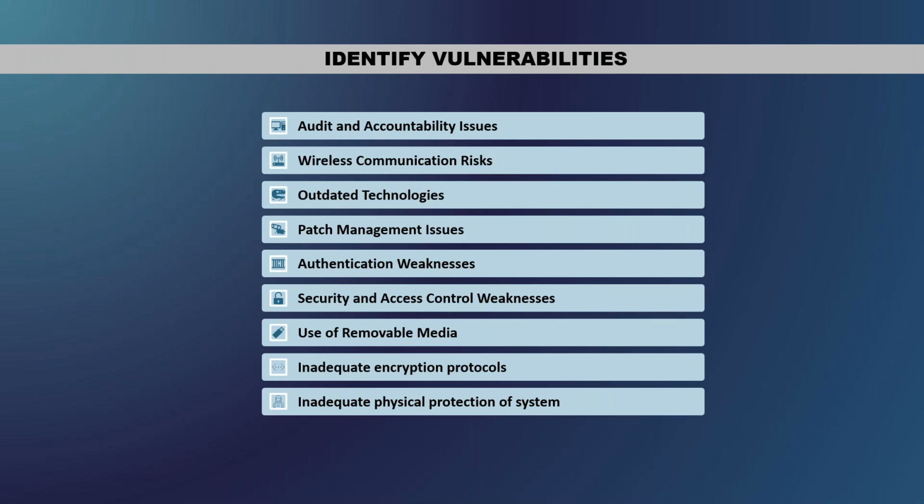So the lack of robust authentication and authorization procedures can also make medical devices vulnerable to unauthorized changes, as authentication verifies the user identity. Many times you can log into an X-ray machine or a portable if all the users are sharing their passwords and information. It's like admin 123 or whatever. So that's a big risk.